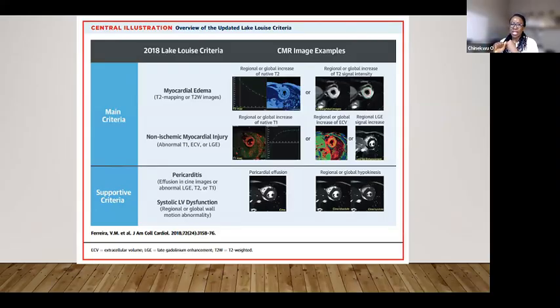Remember, T1 is elevated if we have scar within the tissue, because as the magnetization is going back to its null position, the time it takes to go back is extended if there are a lot of fibrils in there, versus if it's just pure, healthy myocardium. ECV, we've just discussed how we do it, and essentially the extracellular space is expanded if we have scar, because that is what the extracellular space is, right? Collagen. And obviously, late gadolinium imaging is a direct assessment, again looking out for that expanded extracellular space by how much gadolinium hangs around in abnormal tissue versus normal tissue.